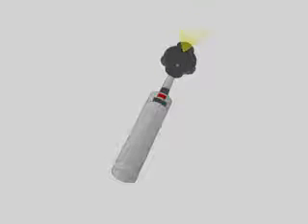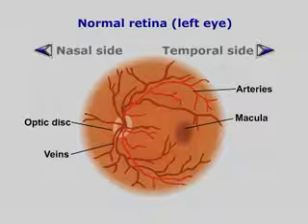The use of the ophthalmoscope is an important tool in making a clinical diagnosis beyond the realms of ophthalmoscopy. Examination of the eyes, especially the fundus, is important as it may reveal signs of pathology in many systems such as endocrine, neurological, cardiovascular, as well as being a useful tool in general medicine. With the ophthalmoscope, you can examine many features, but of particular importance is the posterior part of the eye or the fundus. It includes the retina, the optic disc, the macula and fovea, the choroid layer, and blood vessels.